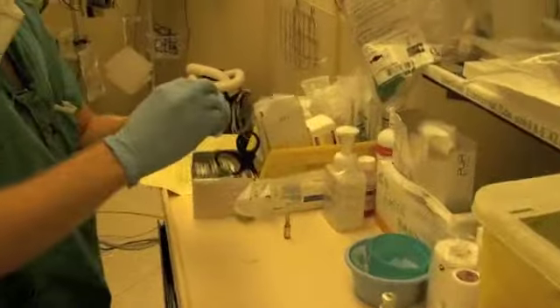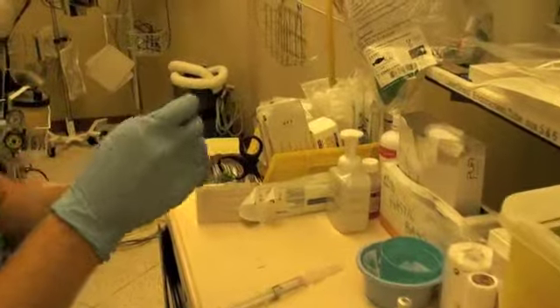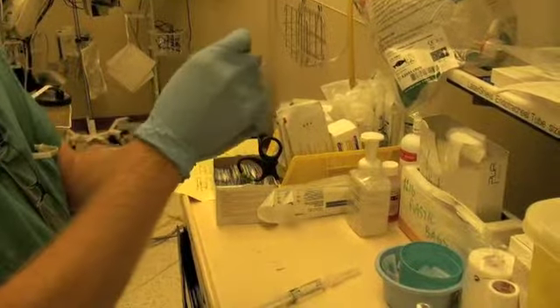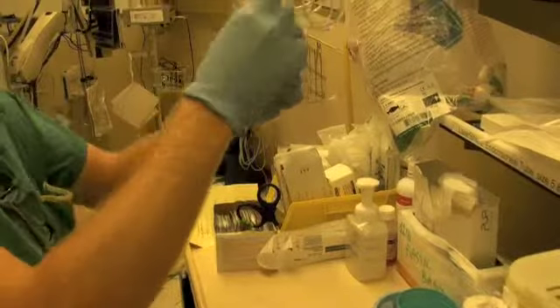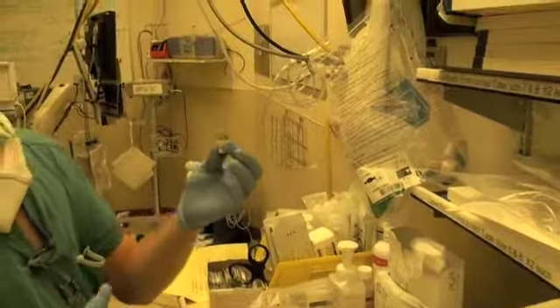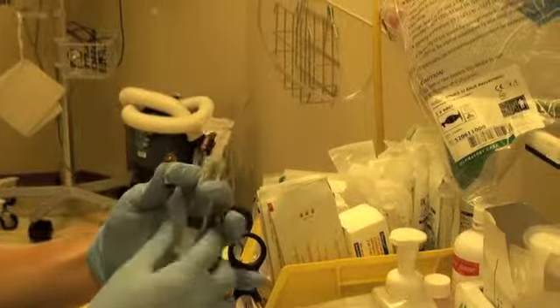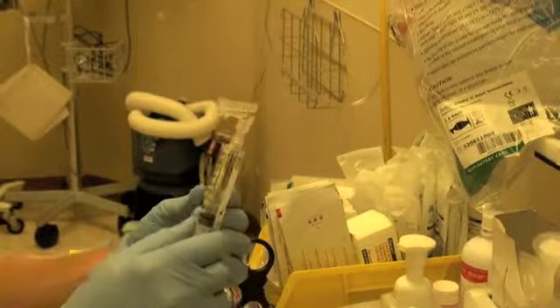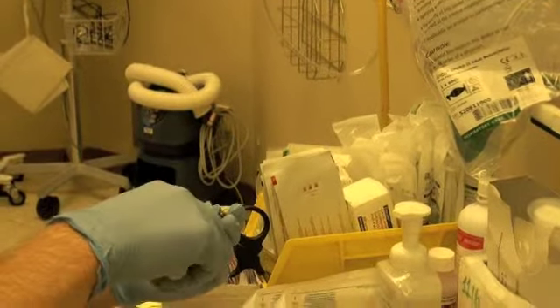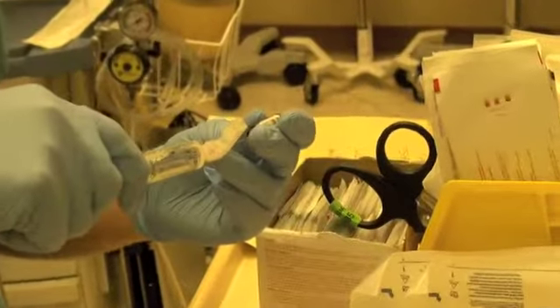Attach our needle. That's ready. And then we'll crack open the ampule of ephedrine. Just get moving the air to the top and crack it open. And note now that this is cracked open, it's open to atmospheric pressure. So when we go to draw our fluid off, we don't need to actually draw air back into the syringe. We can just insert the syringe and pull back until our volume gets to 10 milliliters.